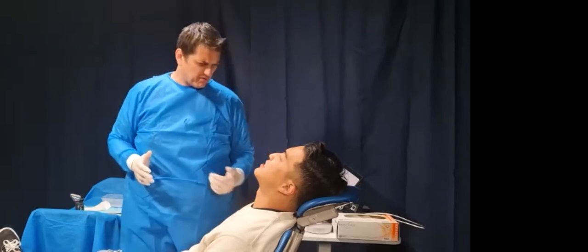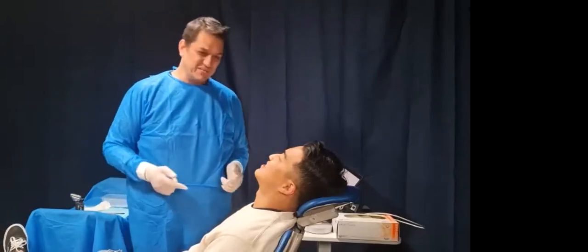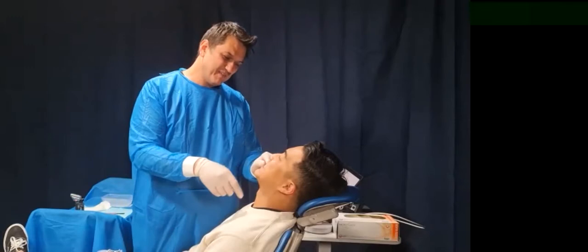Three or so. What do you reckon, 3 mil? Yep, there you go. This guy makes more splints than anybody I know on the planet. He knows, and that's why he's concurring. We can use him for this one here. So opening up for me, opening up.